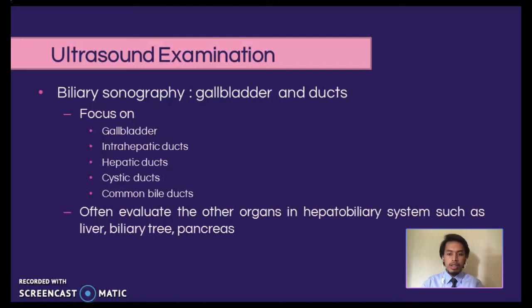When the clinical findings and sonographic findings found in this chapter are consistent with gallbladder disease, the sonographer should closely evaluate the liver, other parts of the biliary tree, and the pancreas for additional complications such as intrahepatic and extrahepatic biliary tree obstruction and pancreatitis.